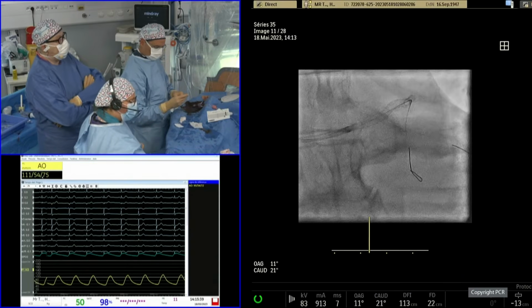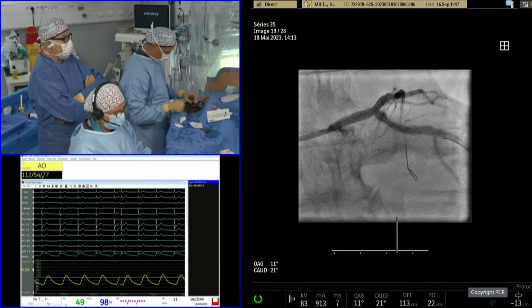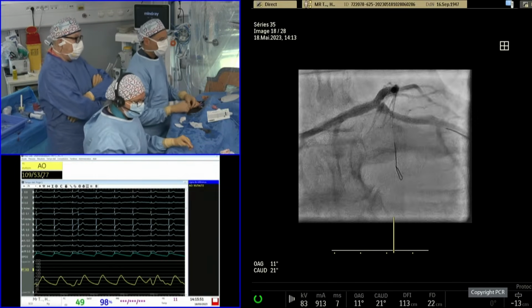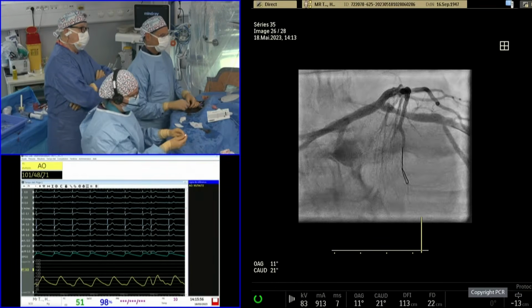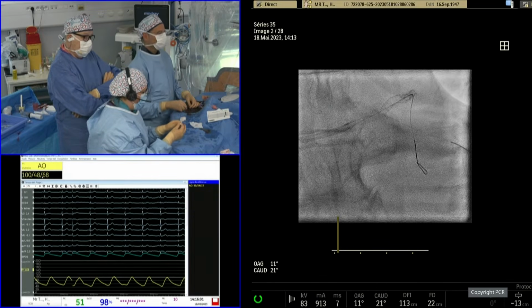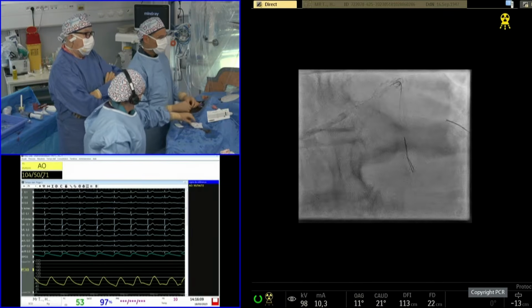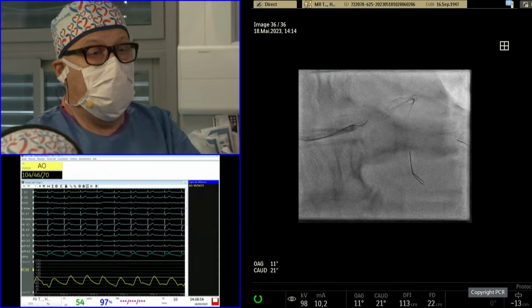And in our practice, we still use kissing balloon on a regular basis for left main lesion. So maybe there is a need to redo the KISS trial with left main bifurcation. I fully agree. The question is valid. Result looks very nice now angiographically. What is your decision making at this point? Routine kissing or evaluation of the plaque and carina shift? We are going to do a routine kissing in this situation because it's a left main.